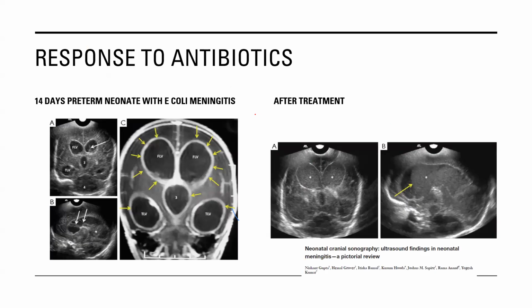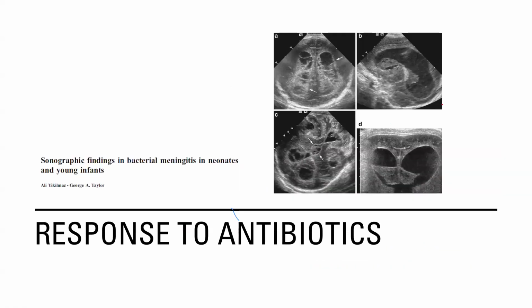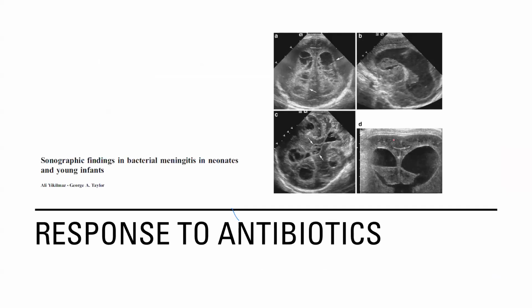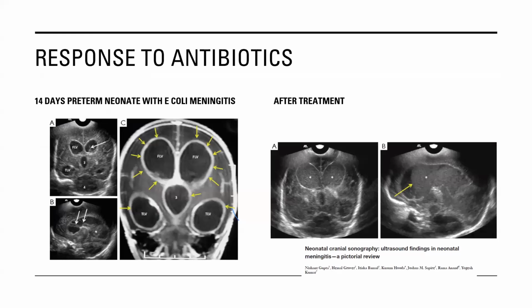And this, Maria asked a question, well, how do you recognize pus? So can you see the echogenicity of this material over here versus the echogenicity over here? So this is echogenic. This might be exudate. This is fairly dark. This is fluid. There's no exudate, and the fluid being dark looks like CSF. But when you look at the echogenicity of this material over here, this is really echogenic. This really makes you worry.